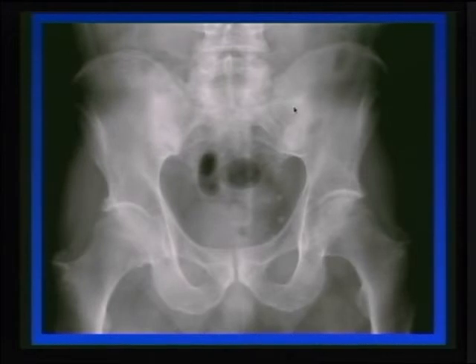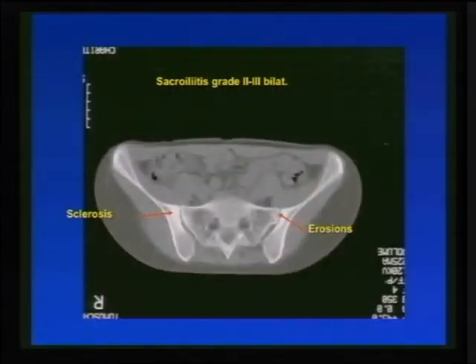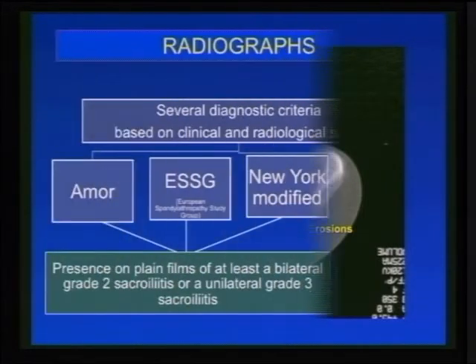So it's really important now to say that this is grade 3 to 4, because you have a high suspicion of fusion. So it's really important to know that this is sacroiliitis, full stop. The sacroiliitis in those patients, you might have presentation with any other clinicians presenting these cases for you. Is it really bilateral osteitis condensans ilii or not? If you see some sort of sclerosis to the other side, you see definite erosions, these are definitive for sacroiliitis.